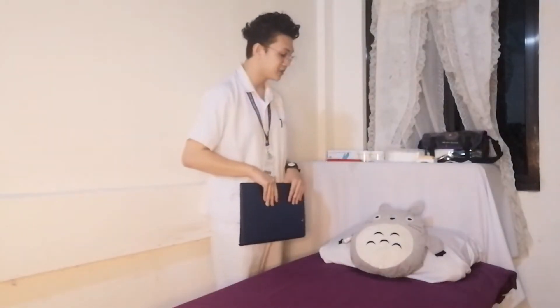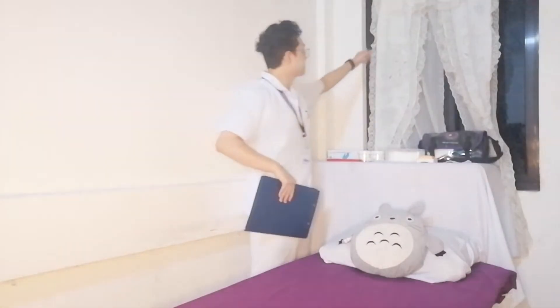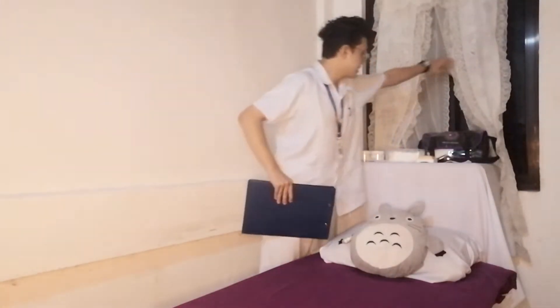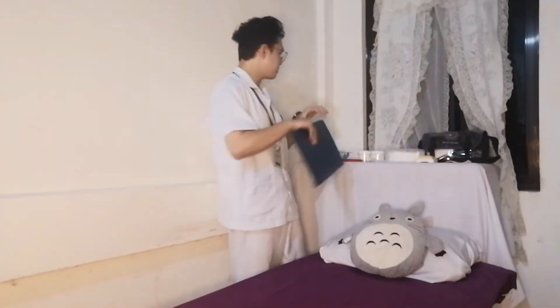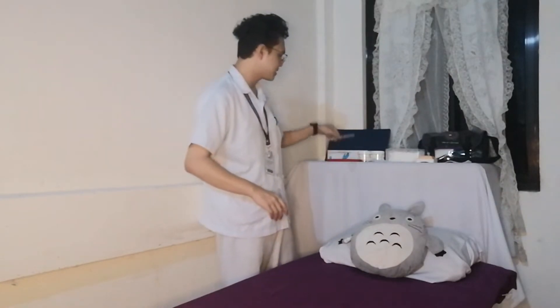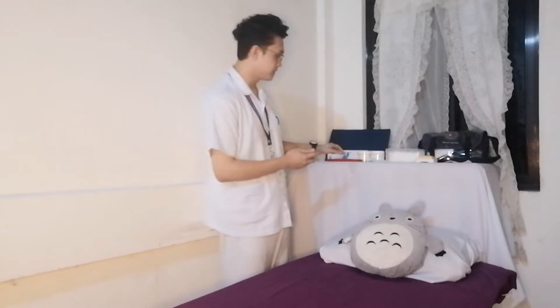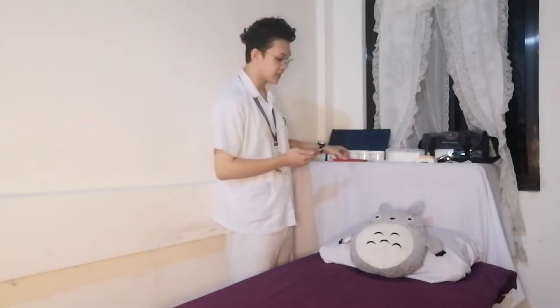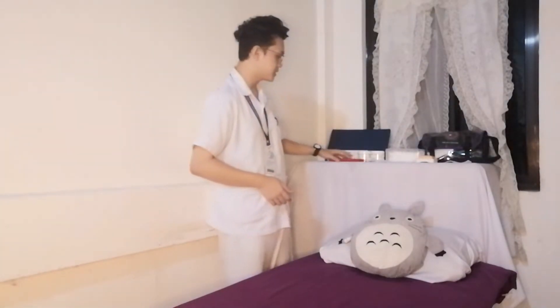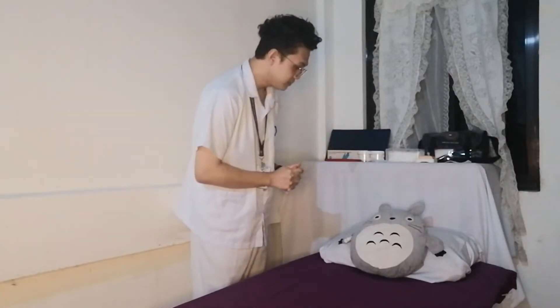I'll be administering your drug for today via the parenteral route. I'll be closing the curtains for your privacy. I already prepared your medication earlier in this syringe together with the medication card for verification of correct dosage and correct drug in this hypodermic tray. I hope you're feeling comfortable right now. Are you ready?